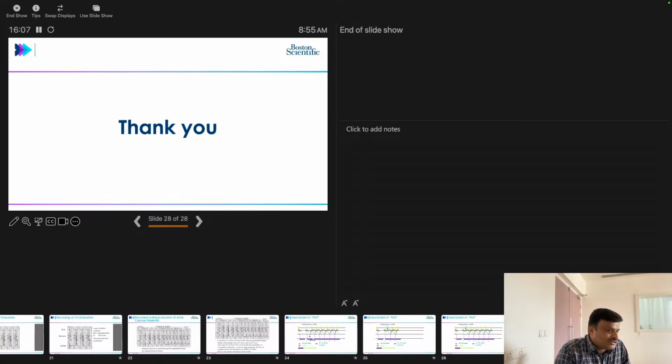Routinely nowadays, sir, we are not doing it because of the rigorous programming from the device side. The majority of the PMTs have subsided compared to the olden days, because nowadays all the companies give an option that either the PVARP or the AV delay automatically adjusts based on the patient profile. So you will see very few PMT episodes now.